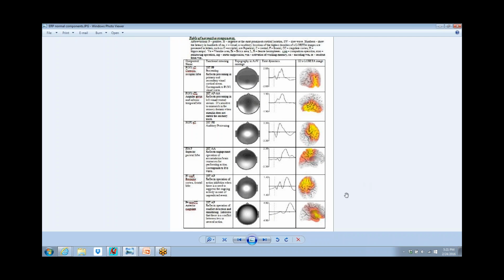So the EEG and ERP together end up being a very nice match, because the ERP, as diagnostically useful as it is, doesn't tell us how to treat the patient. It just diagnostically tells us where everything is. And the QEEG may be diagnostically non-specific, but it gives us great advice as to how and when and where to intervene.